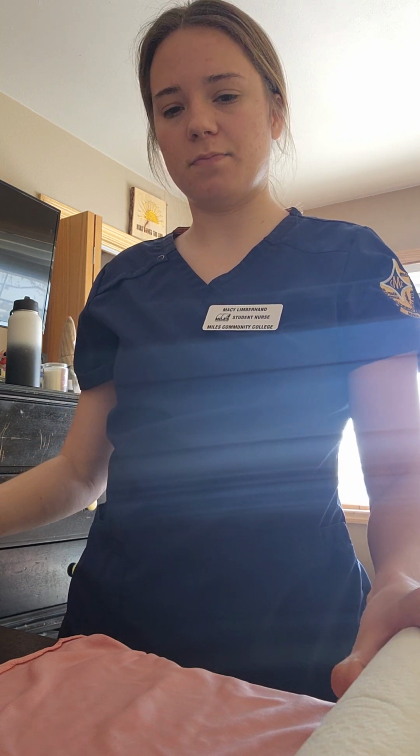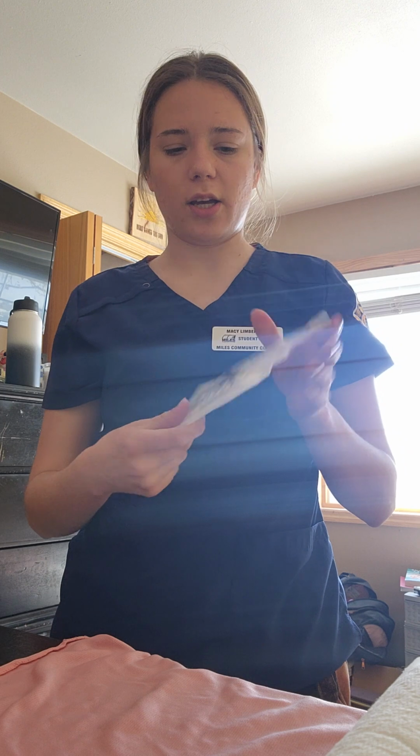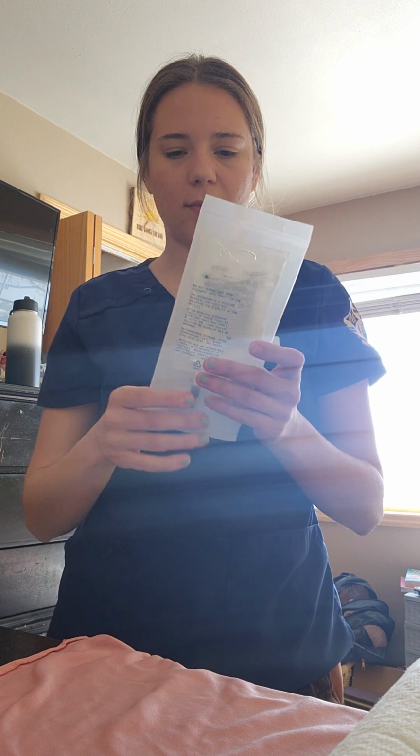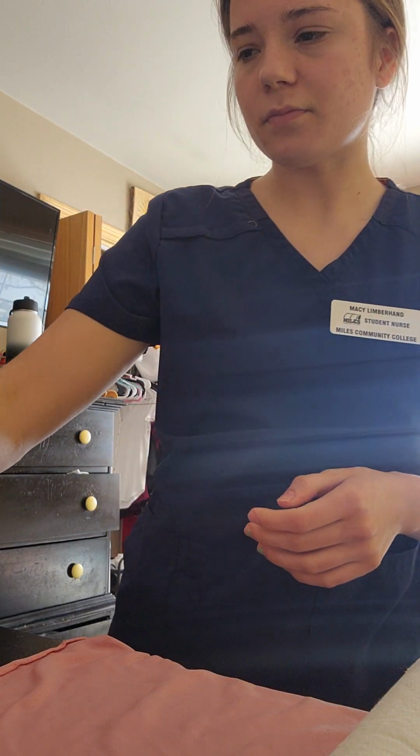gather all my supplies. So I'm going to get a 50 ml bag of normal saline. And when I grab this, I'm going to look at the packaging, make sure it's not open, and check the expiration date, which it's not expired, so we're good there. And then I'm going to look for any particulates in this bag, and there are not any.